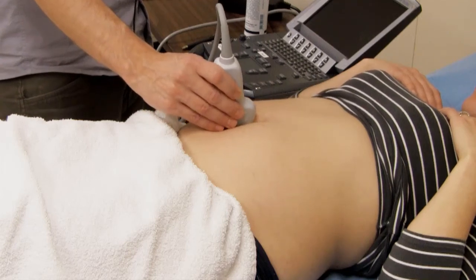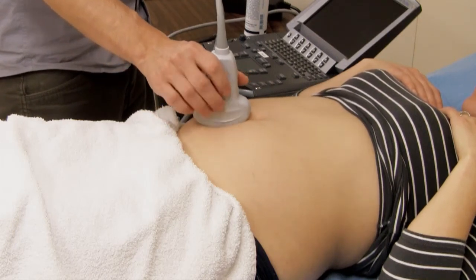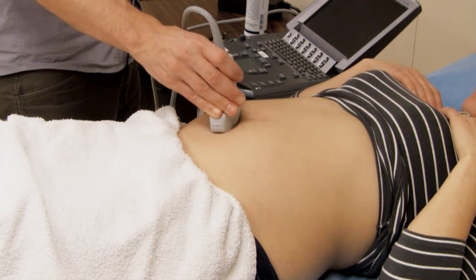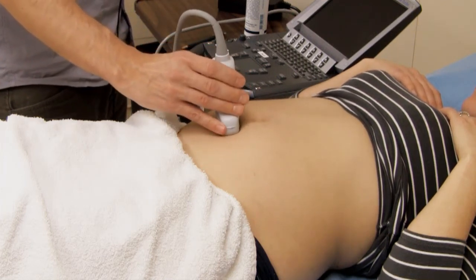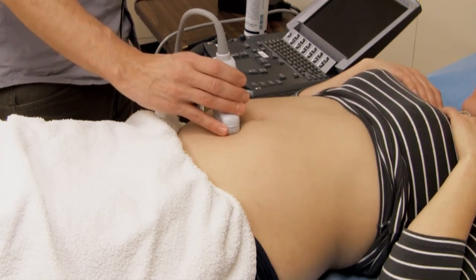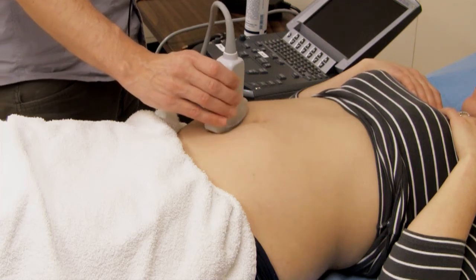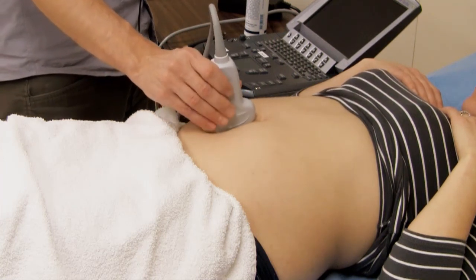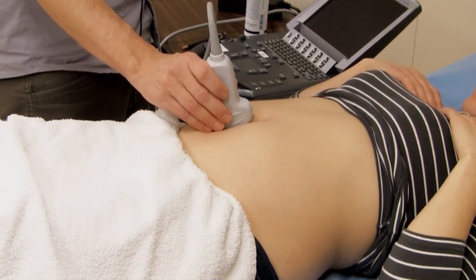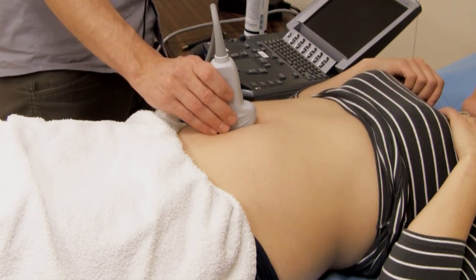Probe rotation occurs when the probe pivots along its own long axis. The center of the probe maintains contact with the skin and the probe moves from longitudinal to transverse or vice versa. When performing any of these probe movements, remember to watch the screen.